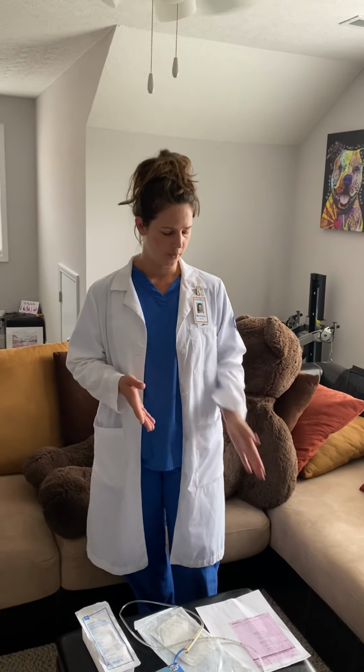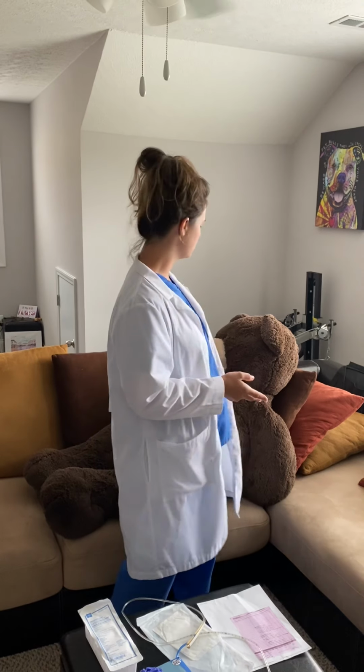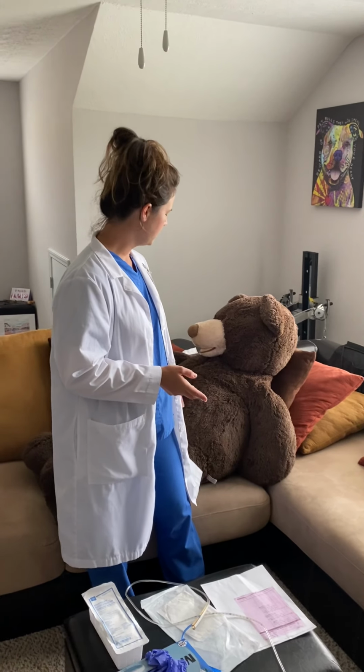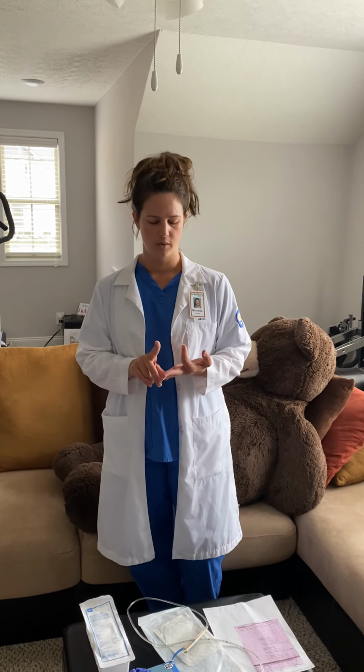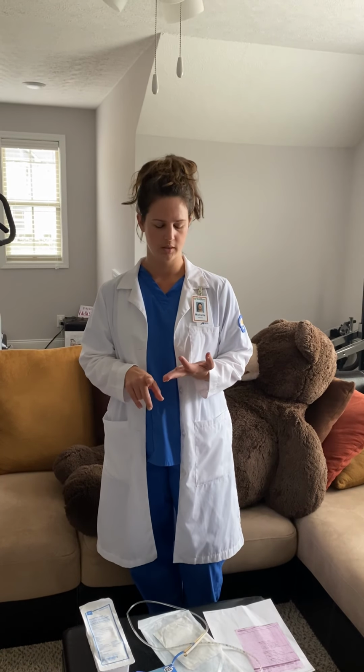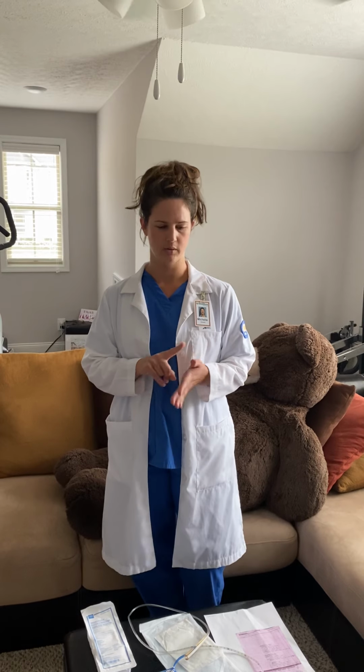And today, per our order for Mr. Gastritis, we're going to be administering a feeding, a Glucerna feeding. So for the 6 patient rights of medication, you want to make sure you have the right medication, the right documentation, the right patient, the right route, the right dose, and the right time.